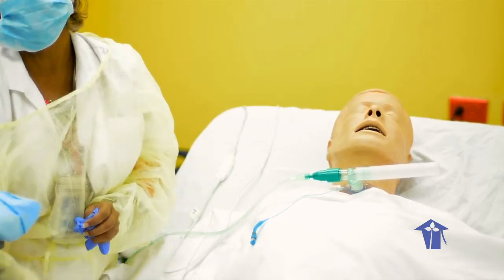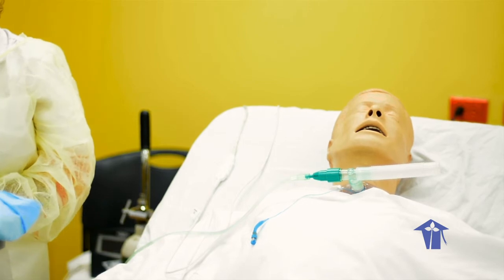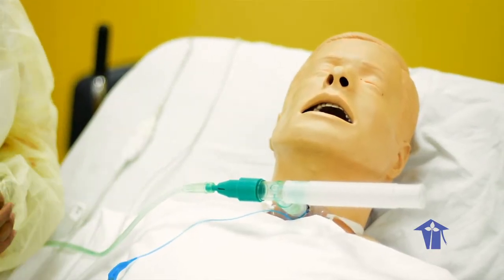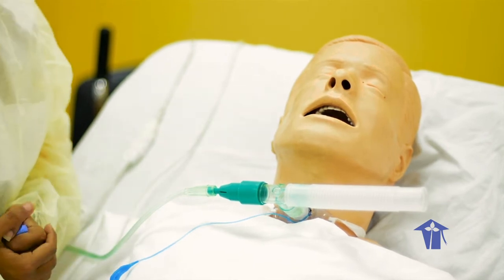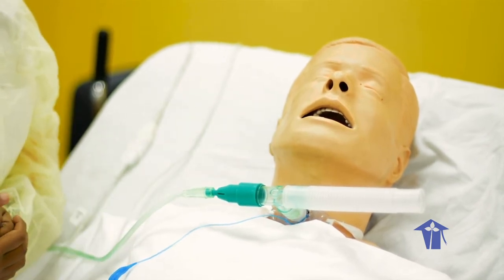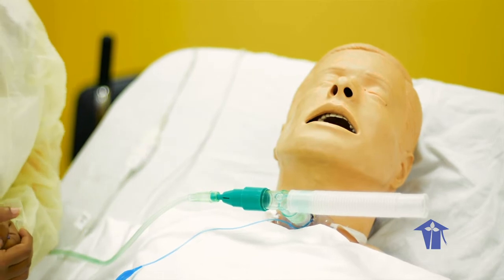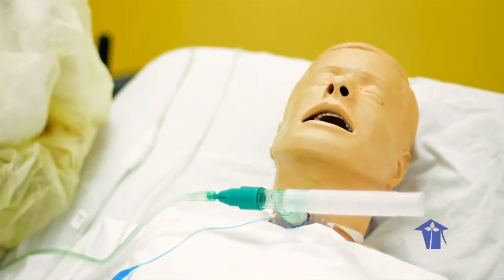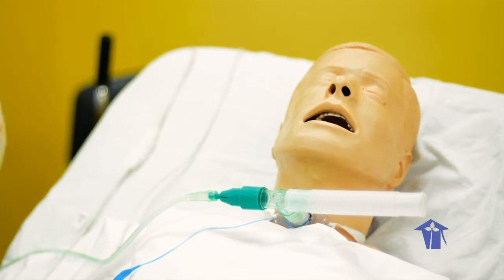Reassure patient you will interrupt procedure if he or she indicates respiratory difficulties. All right, I know you won't be able to talk right now, but anytime during the procedure, if you feel that it is uncomfortable, I want you to blink or close your eye very tightly for more than 1 second for me, and I will know that you're having some challenges and I will stop.